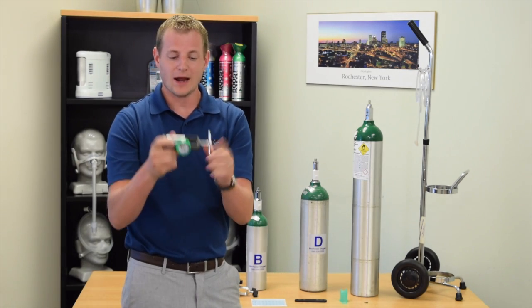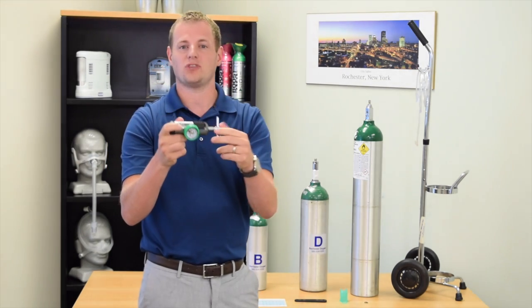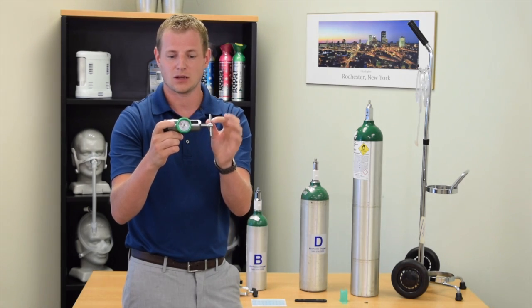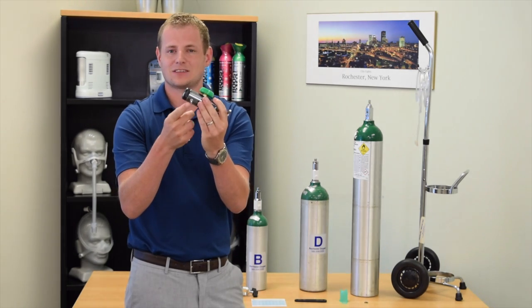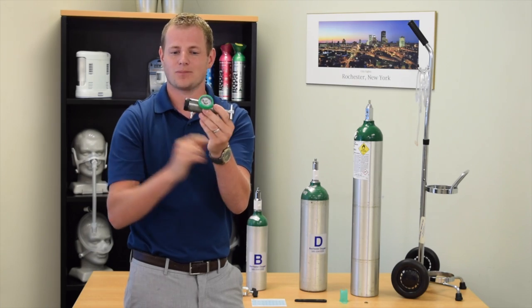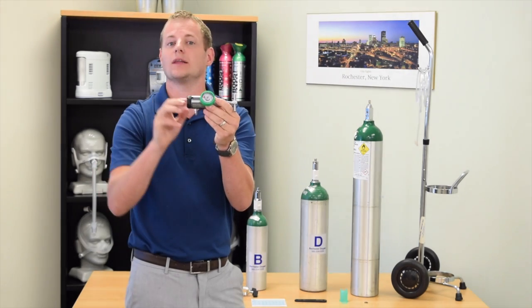Each regulator has a T-bar, which can be spun to the out position when placing on a tank, a gauge which should read zero at this point, and a spot for your oxygen cannula, as well as a dial for setting liter flow.